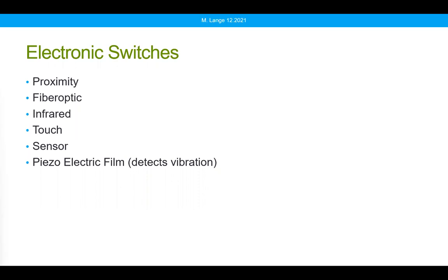Another option is you could plug that switch into a splitter cable. One cable will go to the assistive technology device, like a communication device. The other cable can go into something that beeps, and you can sometimes use a switch tester. And I believe Ablenet still has some switch testers that light up or beep. And that way the person can perhaps hear that sound. It'll probably drive them nuts after a while, but it might help them get over that little bit of a learning curve.